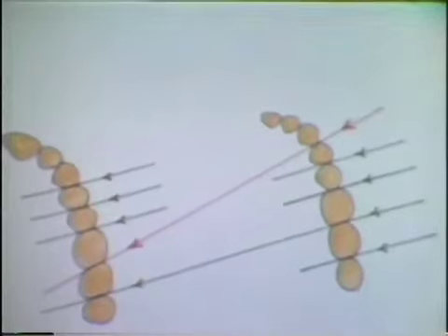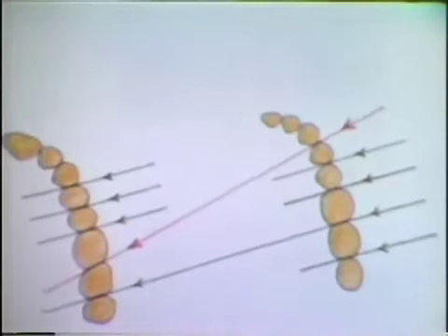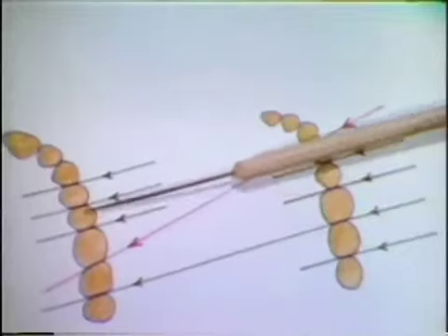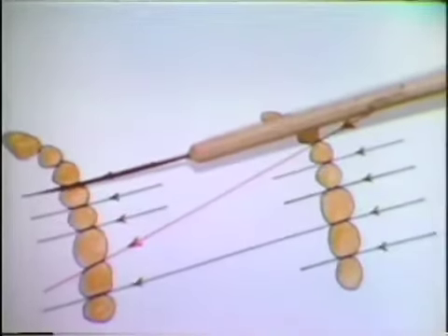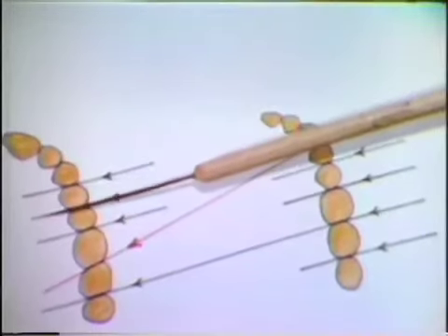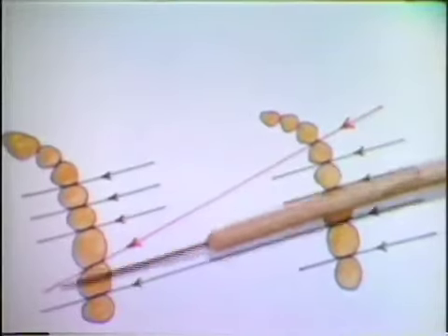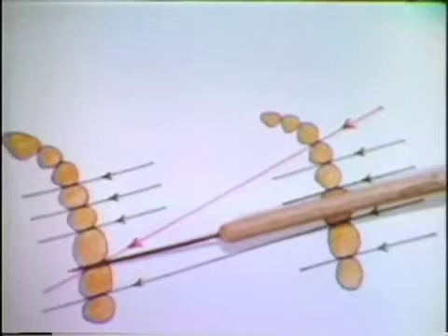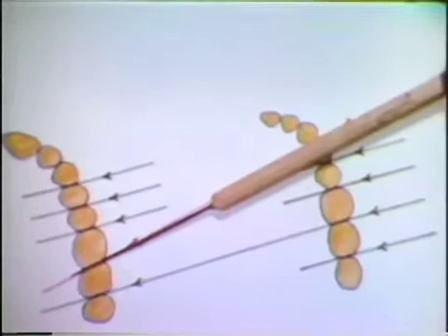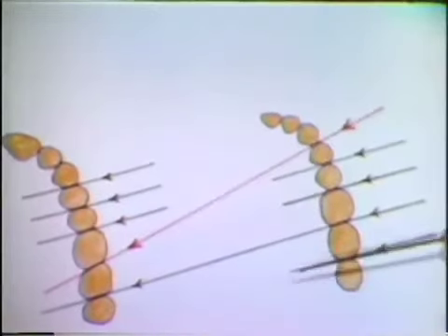This diagram outlines the occlusal quadrants of one side of the mouth. The maxillary segment is on the left. The mandibular is on the right. If the upper second bicuspid is not rotated, a line through its cusp tips will serve as a directional guide for the X-ray beam. The beam, so directed, will be suitable to open most contact areas in the maxillary segment. The interproximal area between the first and second molars is different, however, and the beam must be directed along the red line to open this contact.